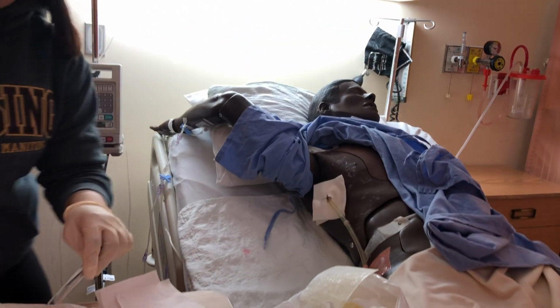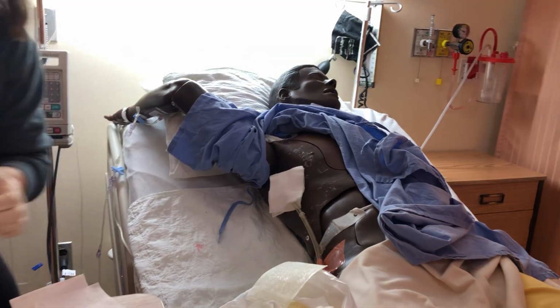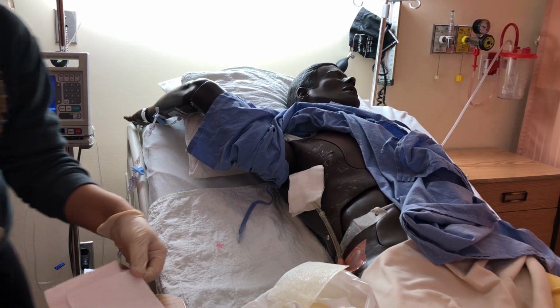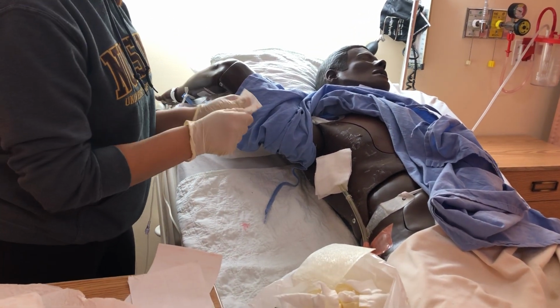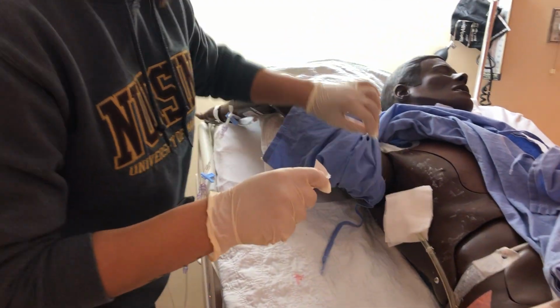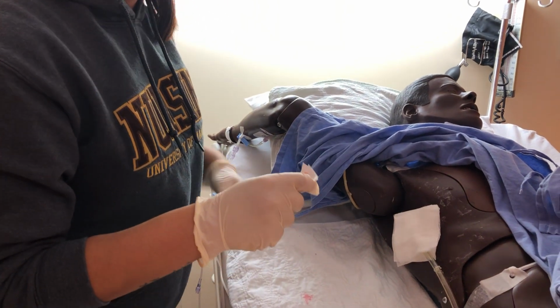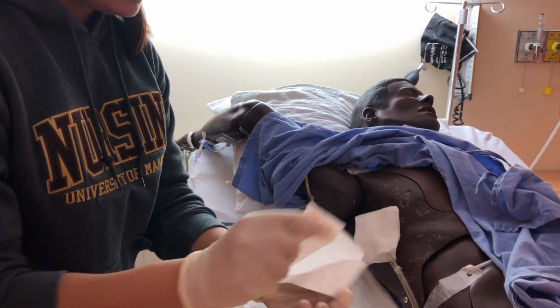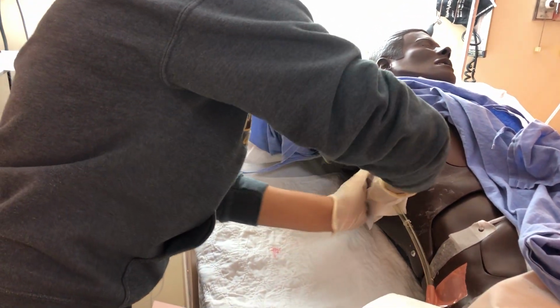Okay, that's good. I'm gonna place a 4x4 on. And now I'm gonna apply my mefix. I'm just gonna move the gown a little bit.